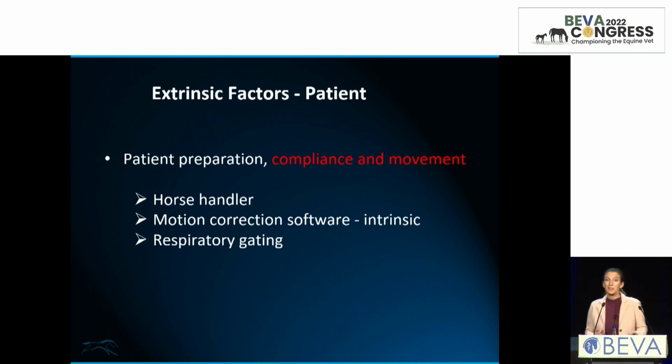That brings me to the horse handler, often unfortunately very much overlooked, but for me the horse handler is doing a super important job during the scanning and before, to create an environment where the horse is as relaxed as possible.